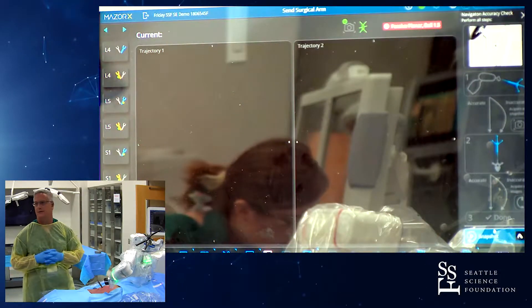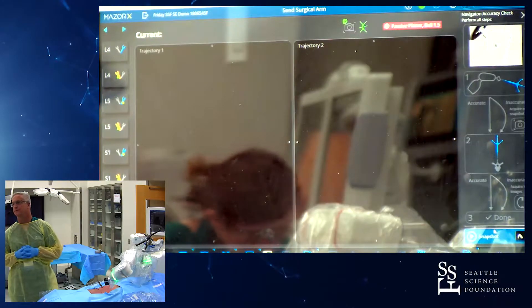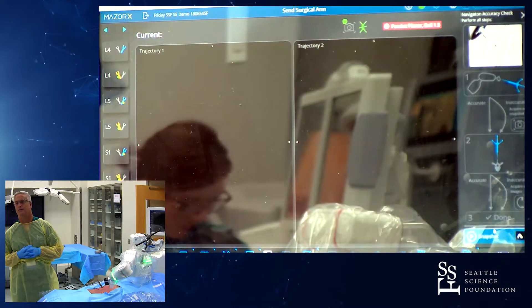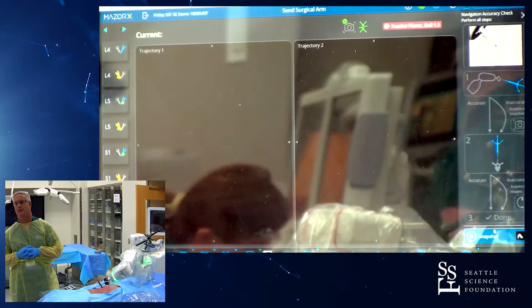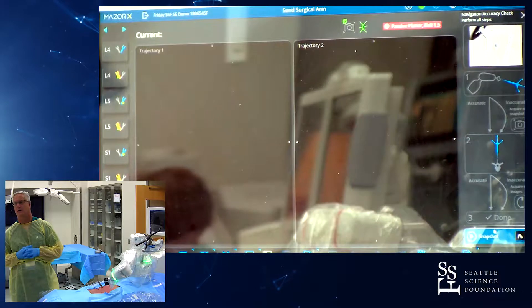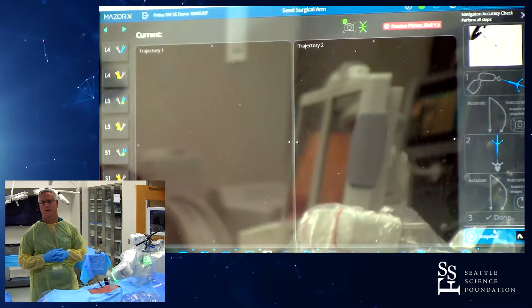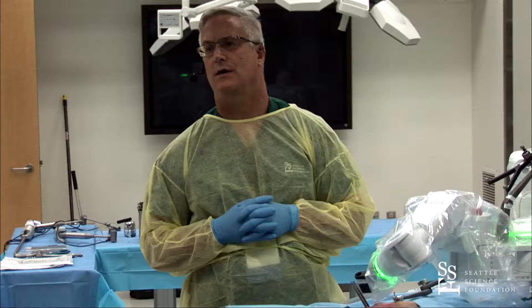I can place another screw if you'd like, or we can move on. I have a couple of questions for you: if you were doing a spondylolisthesis at this level, do you put all your screws in through a single stab incision at each one? And then if you have work to do in the midline, you go do a midline incision — is that how you would do a case like this?